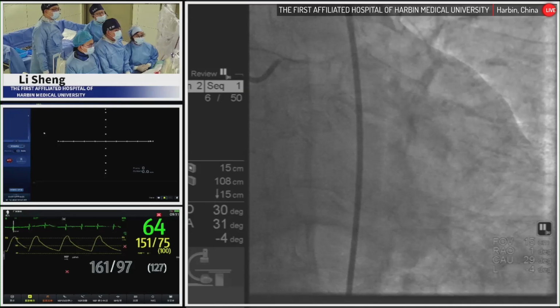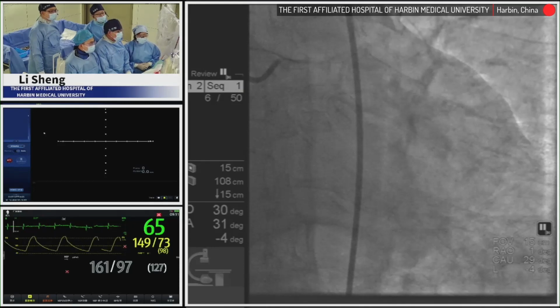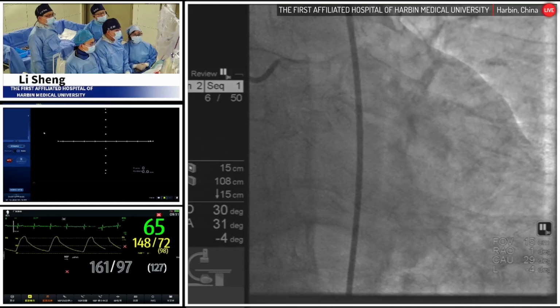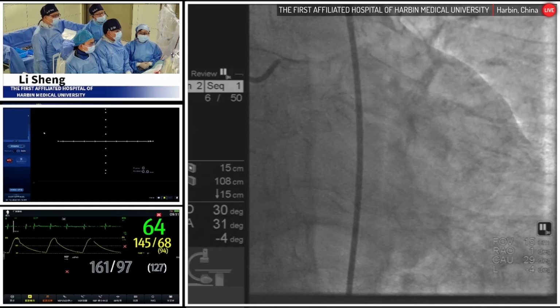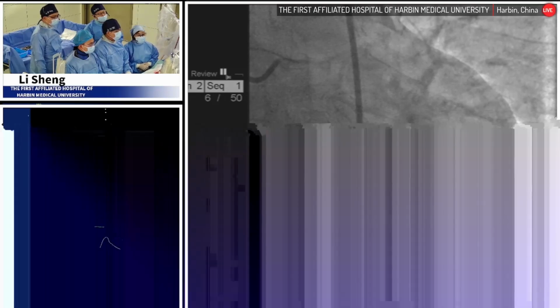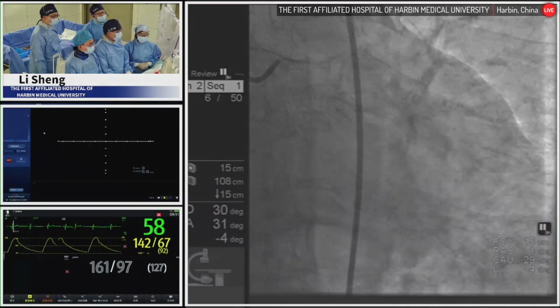Single or two stents, which strategy should we select? We know that distal left main lesions are one of the most difficult objectives in interventional cardiology. We know that the single stent strategy is superior to the two stent approach. According to the Medina classification, this lesion should be classified as 1,1,0. The guideline recommended a provisional stenting strategy.